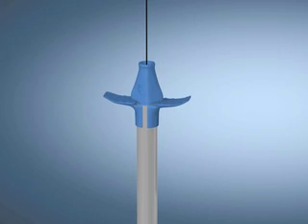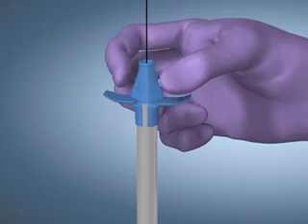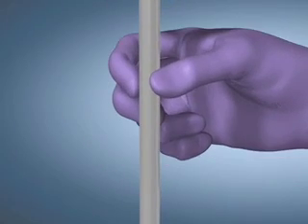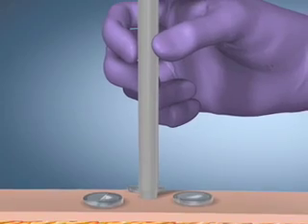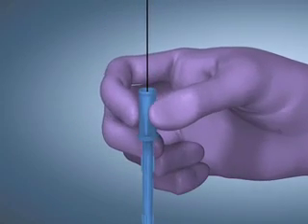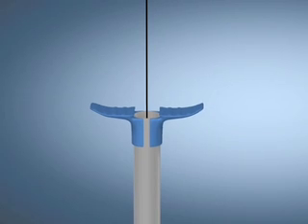Twist the dilator hub to release the peel-away sheath from the dilator. Lubricate the exterior of the peel-away sheath with a water-soluble lubricant and advance the sheath through the tract and into the stomach. Remove the dilator and J guide wire, leaving the peel-away sheath in the stomach.